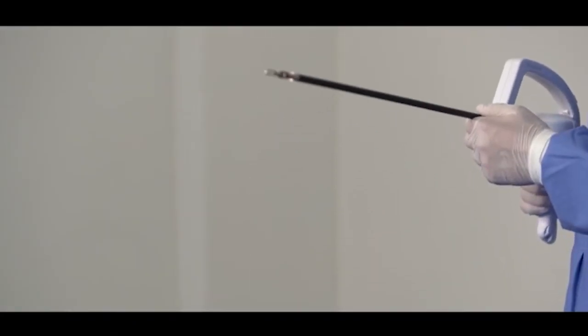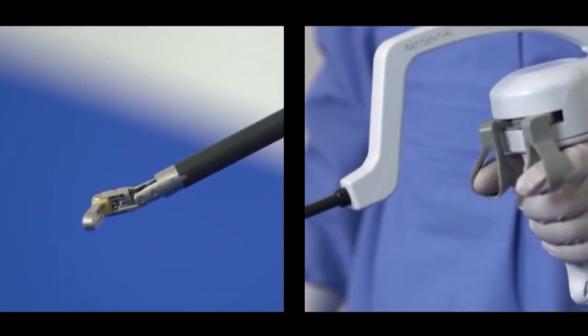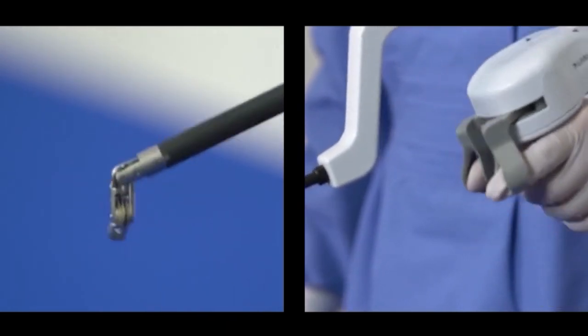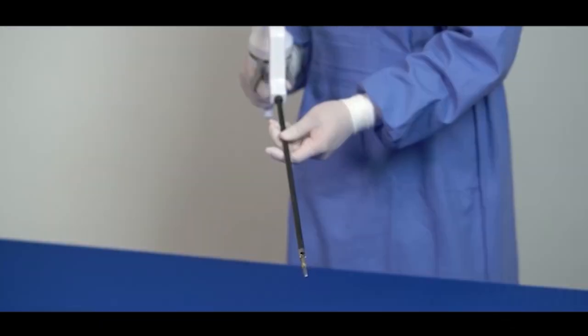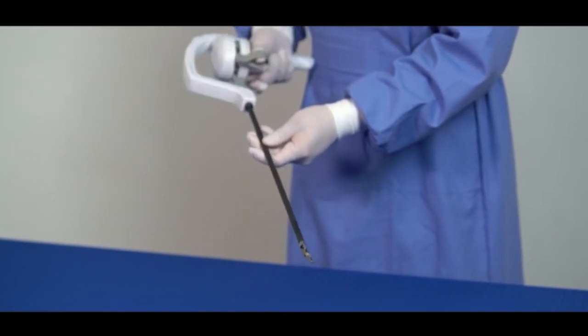Yeah, you know, any new technology requires training, right? So anything we do that's new and different requires our ability to train and practice. You have a double jointed end effector with the LivsMed instruments. The user controls the instrument, and the way I move my wrist on the handle of the instrument then produces the end effector movement. So I have to be in sync. So when I move my hand up, the instrument goes up, down, it goes down, left, right, it goes left or right. And you're able to do these movements.